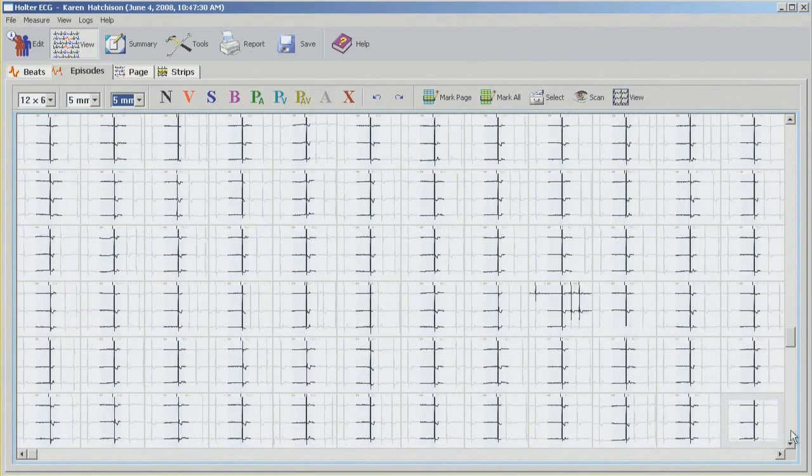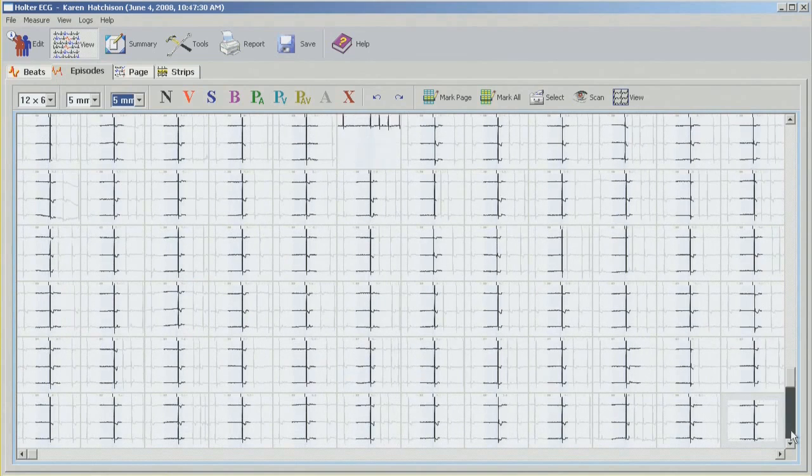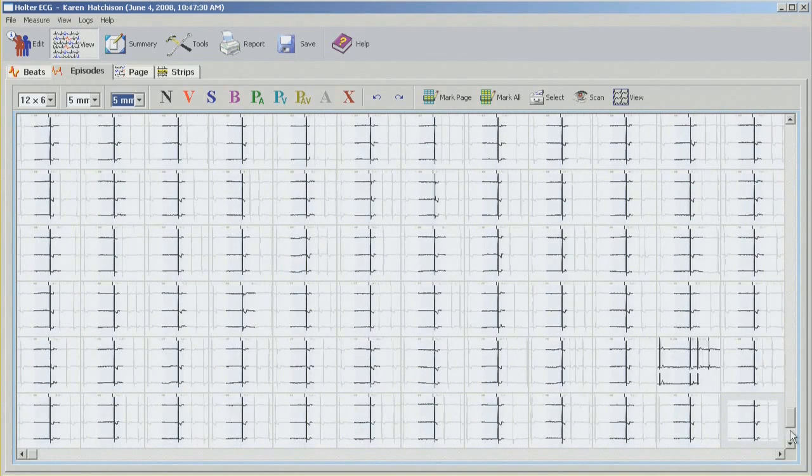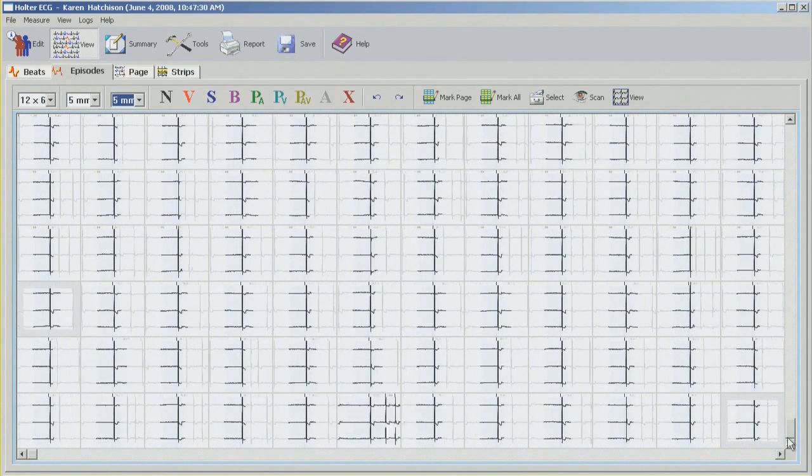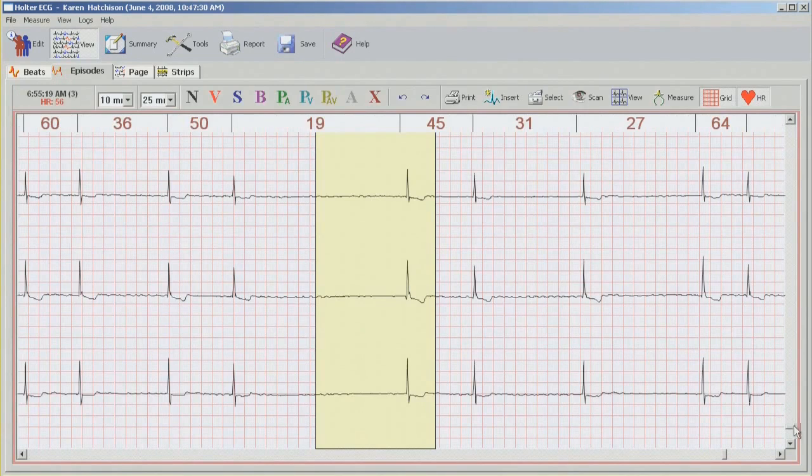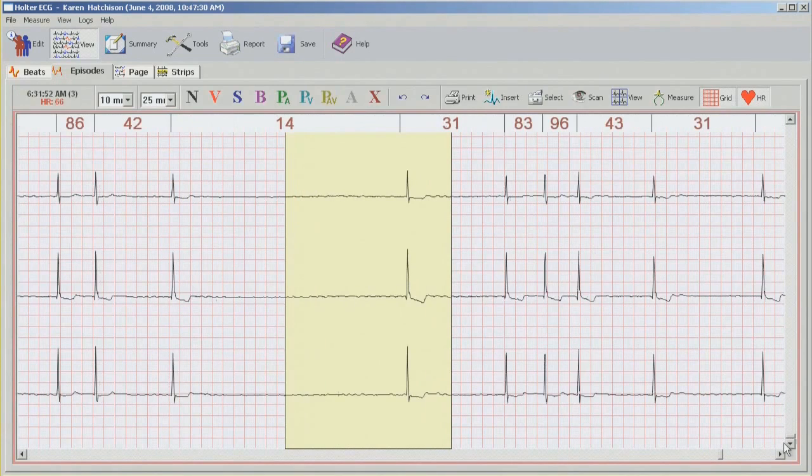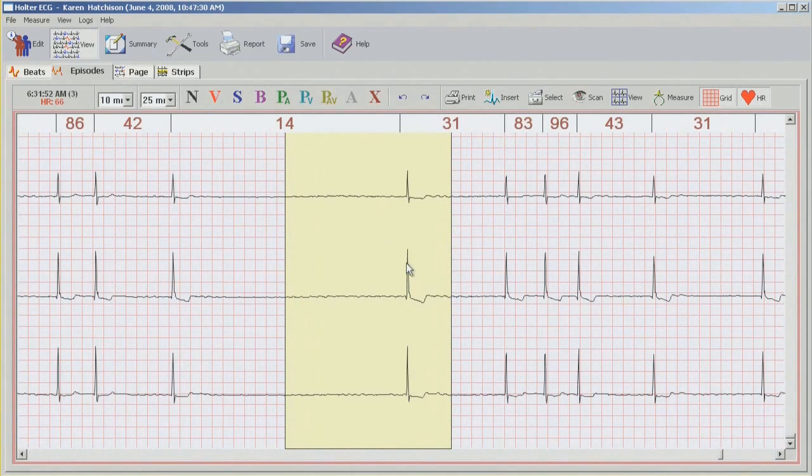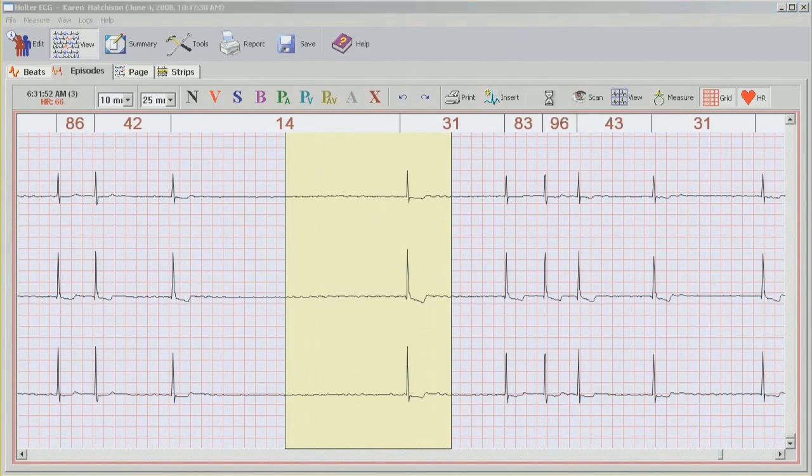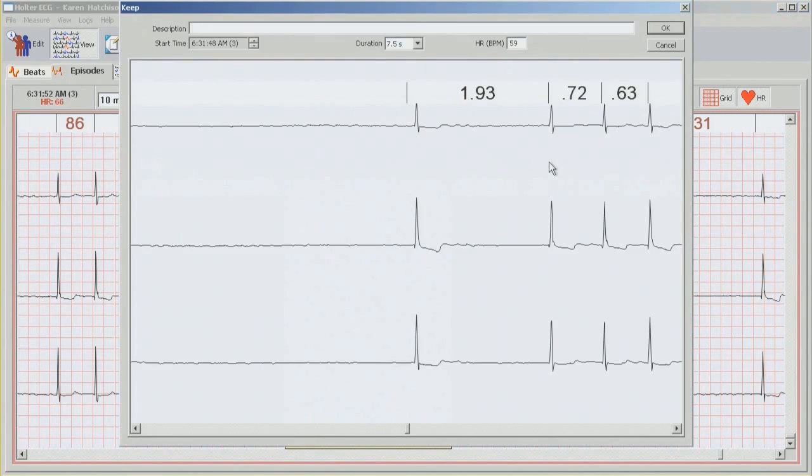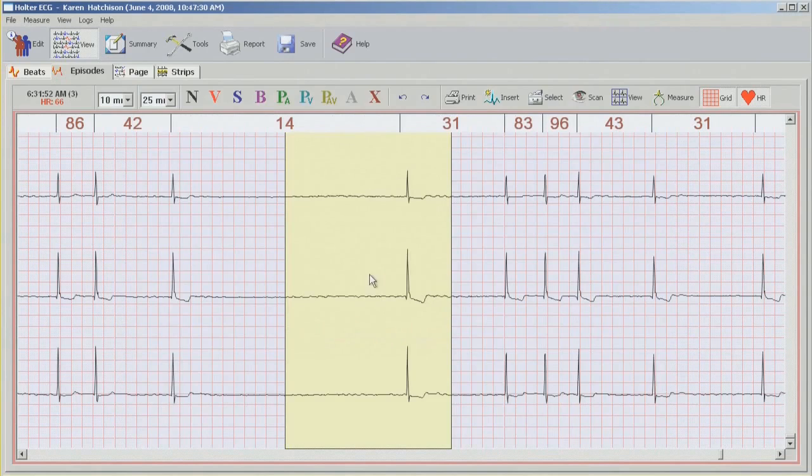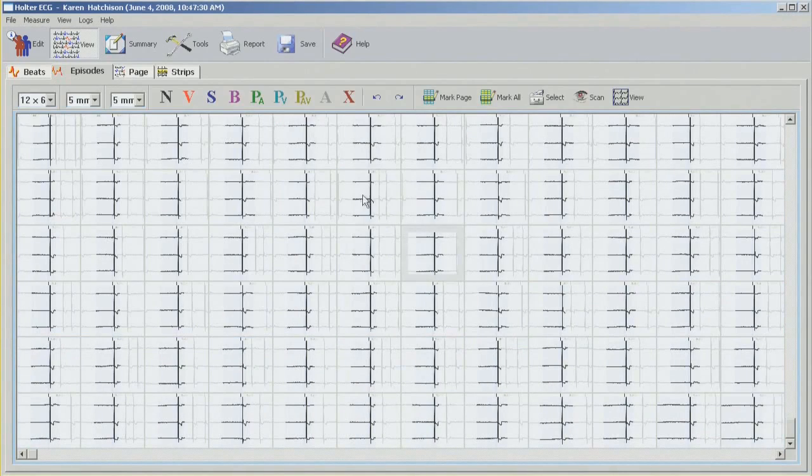Just to make sure there's no other pauses that I'm missing. And all these seem to be fine. So double click on the last one, scroll down, and this is where we come across our longest pause. So I'm going to create a label by clicking on select and just labeling longest NN. Double click to go back to where I was.